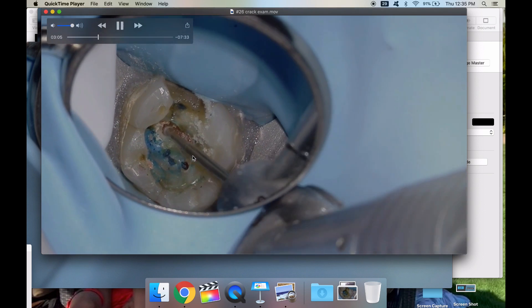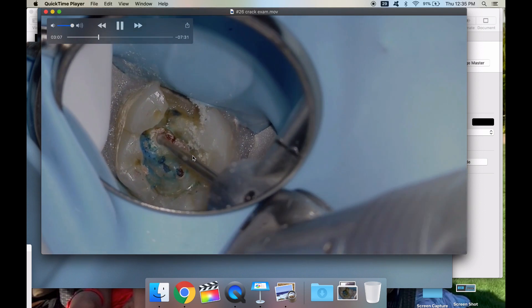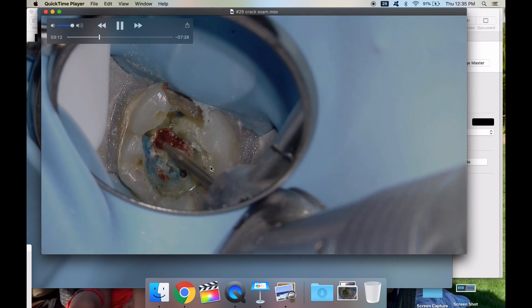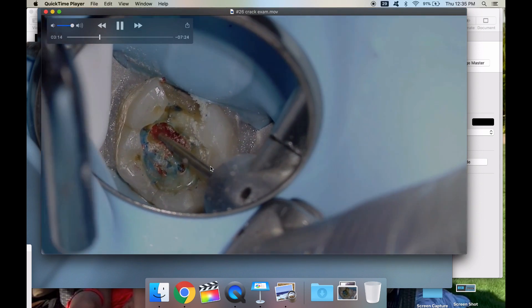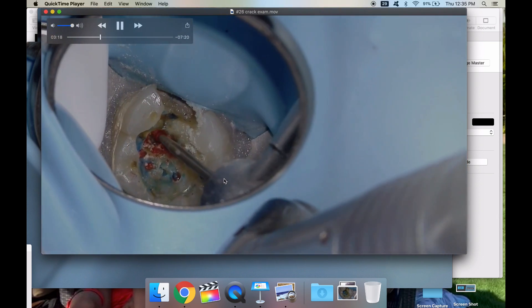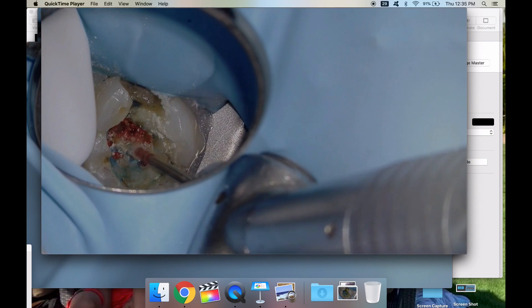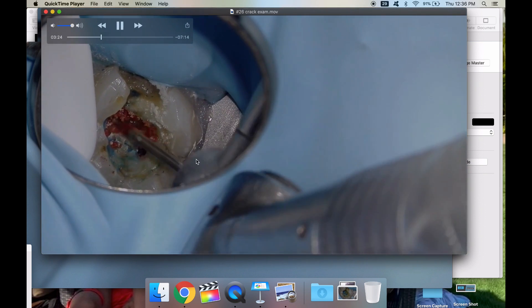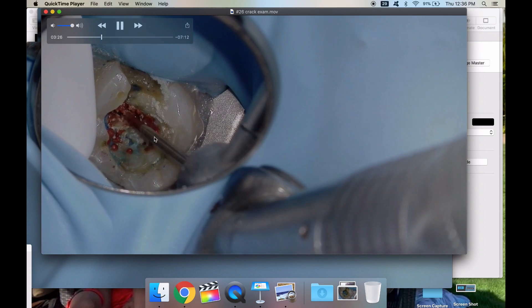The dental assistant came and grabbed me and said there's a huge crack in this tooth — look at the radiograph, which I'll post later, it's crazy. I wanted to give this patient a little more time to decide what we're going to do, so let's get her out of potential pain because she's going to be super sore afterwards if we didn't do the endo.